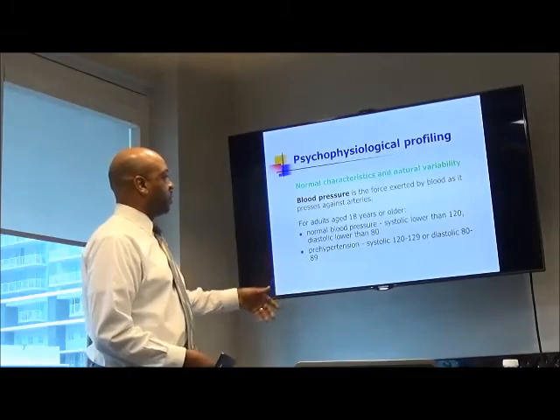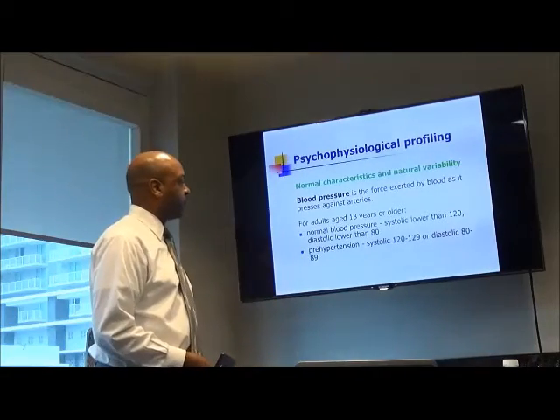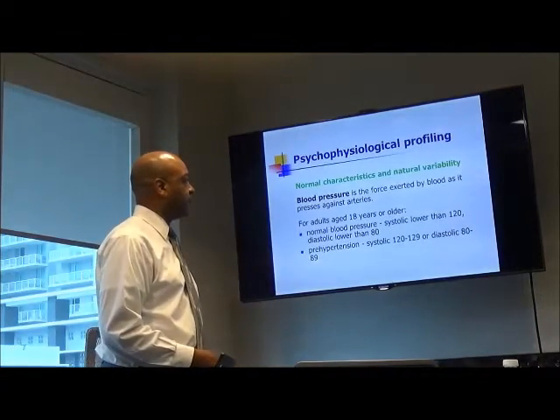This is talking about blood pressure, if we were using blood pressure with the stress assessment.